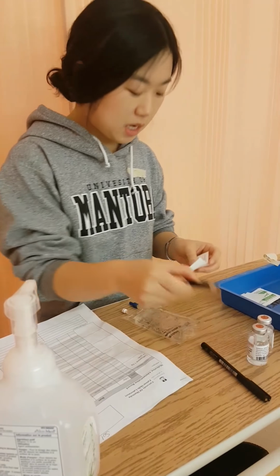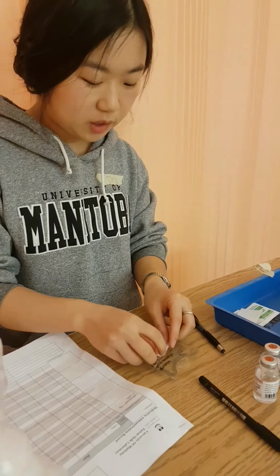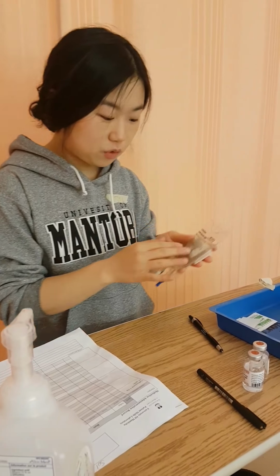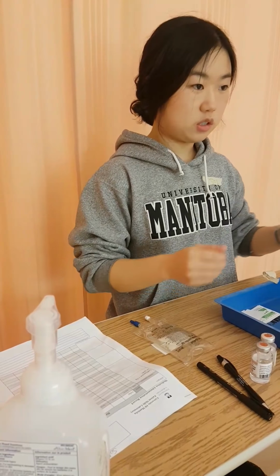I'm going to write in the date and the time. So the date and the time is today and right now. And I've signed it with my credentials and my signature. So I'm going to put it at the back so it doesn't block any important information that's on the front. And I'm basically ready. I'm just going to get all my supplies before I enter the patient's room.